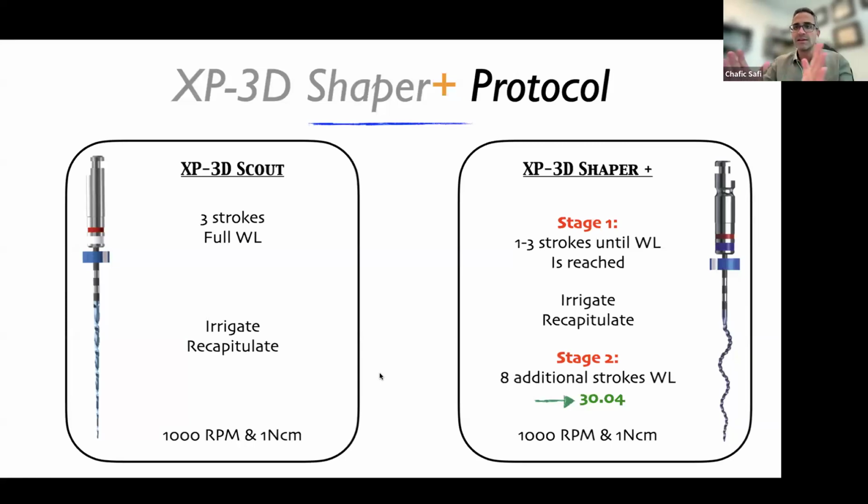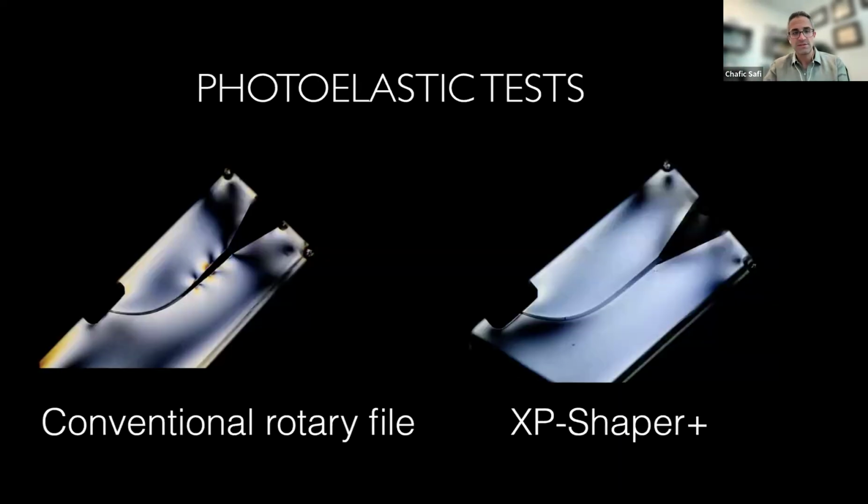You're going to streamline everything. It's going to be an easy start to an easy finish. You just set your settings to be the same for these 2 files. And this makes your life and the life of your assistant much, much easier.